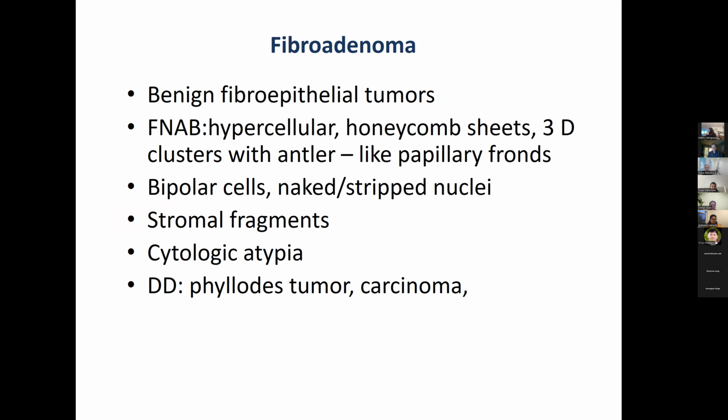Your main differential diagnosis would be, of course, a phyllodes tumor. And of course, if there's a lot of atypia, you might be concerned for carcinoma.